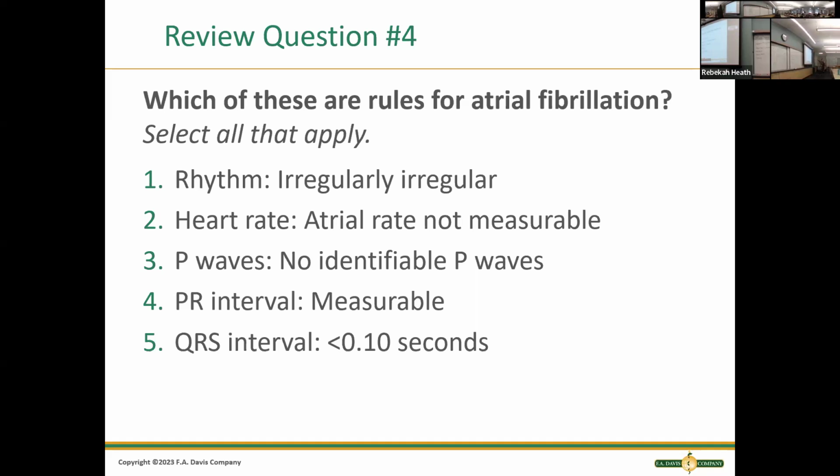Three, P waves. With atrial fibrillation, we can't really see the P waves. We just see the squiggly line. With atrial flutter, that's where we have that sawtooth wave pattern. We can measure atrial flutter waves, but not with atrial fibrillation.